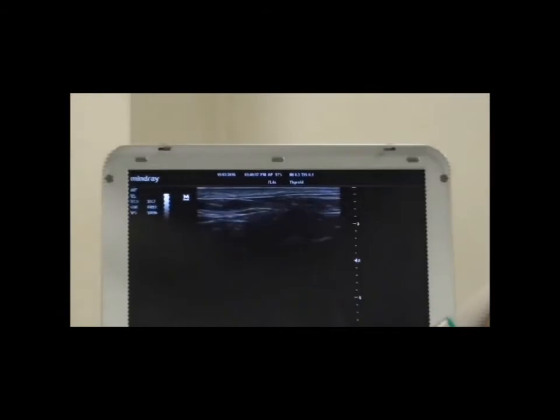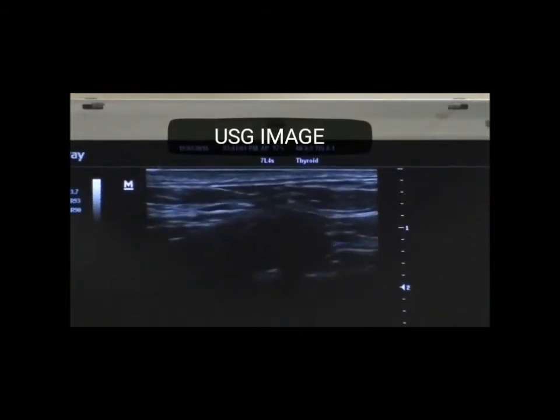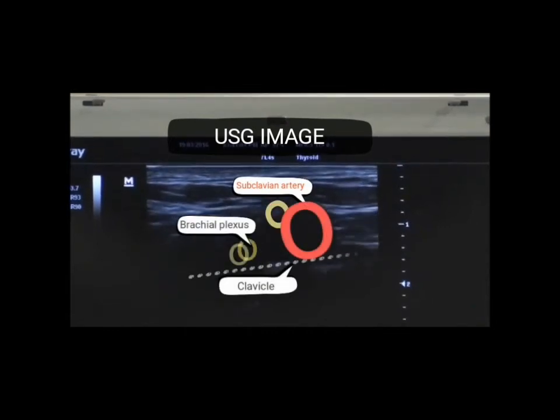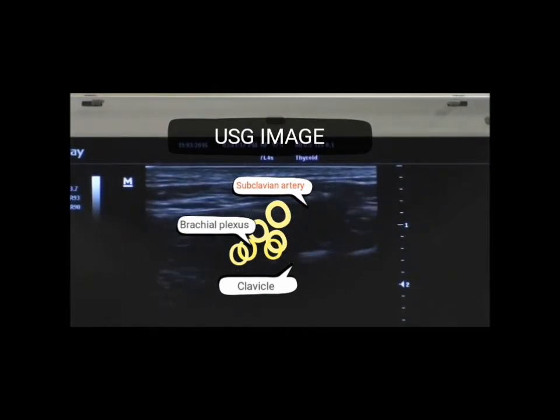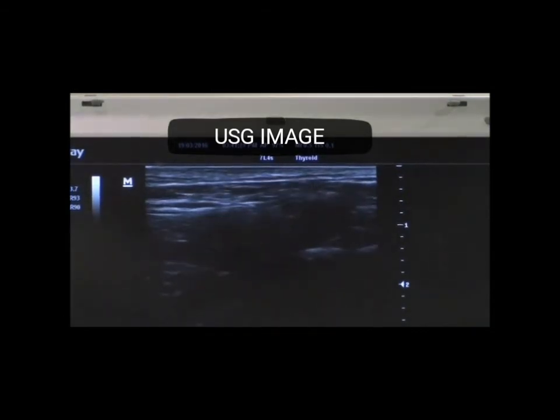In the ultrasound, we will be locating the pulsating subclavian artery — that will be our landmark. The pulsating subclavian artery lies above the clavicle. We can see the pulsating subclavian artery, and superiorly and laterally to that, we can see the bundle of brachial plexus.